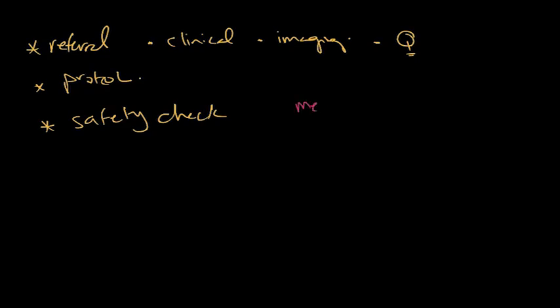You need to know any medical condition your patient has, medications they take. If your patient has very frequent seizures, for example, you need to know about this. You don't want to be surprised by your patient having a seizure inside a magnet. You need to know about any implants or any devices. You need to check if it's MRI compatible or incompatible, and you can check mrisafety.com for this. You need to know any pacemakers or ICD. This probably will be a topic of a different day to go into more detail about this.